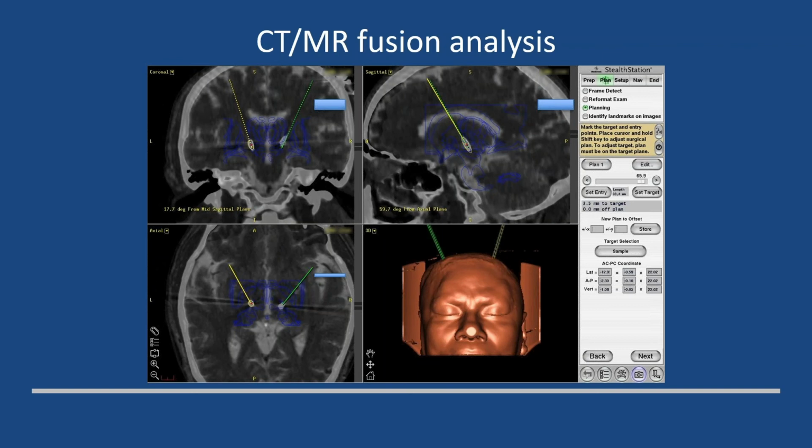You see the anatomy, you can actually see the STN on the MRI, but you can see the bone, and most importantly, you can see the tip of the depth electrode on the 50% CT image. If you want to, you can also fuse it with the Schaltenbrand Atlas, so you can make absolutely sure that your electrode is in the right and in the calculated position.